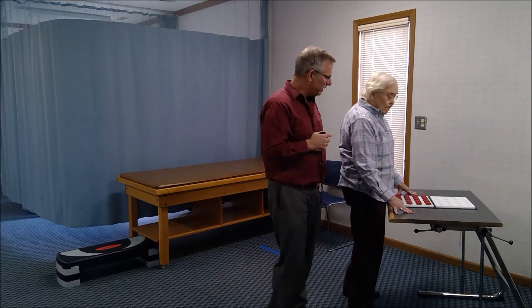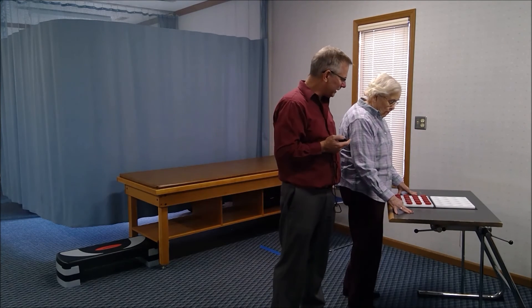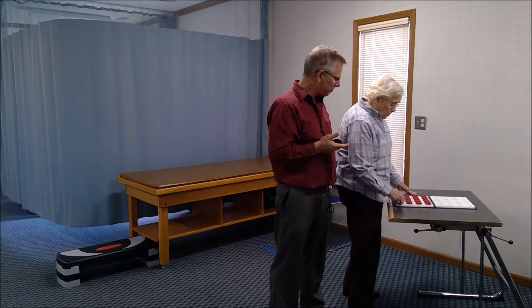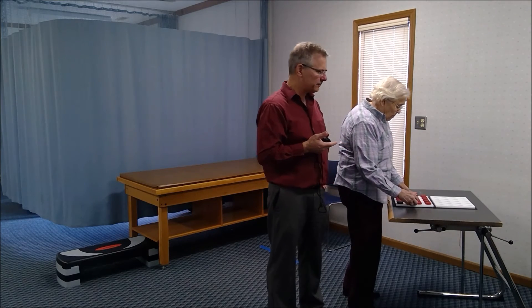Good, now we're going to do it one last time with the right hand only. Go, make this your best one.